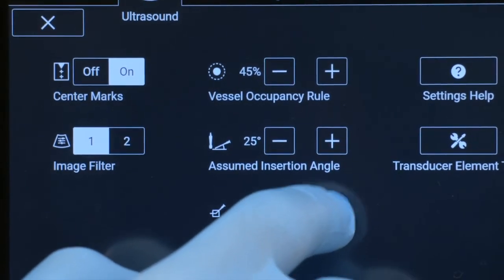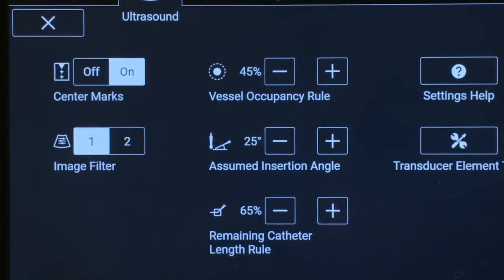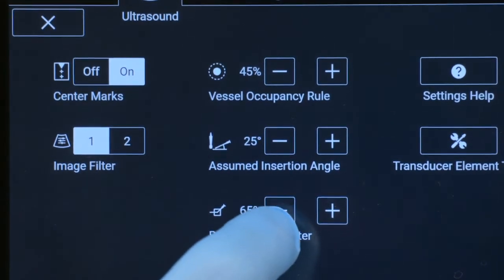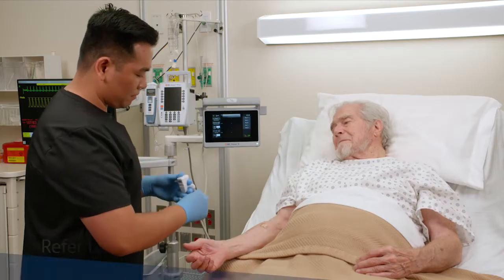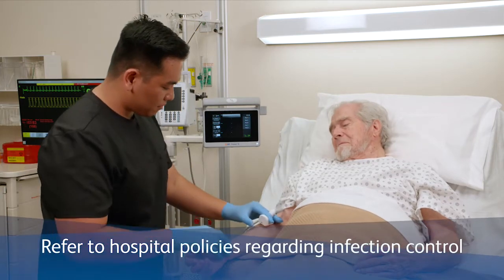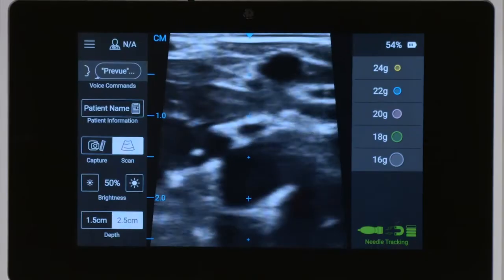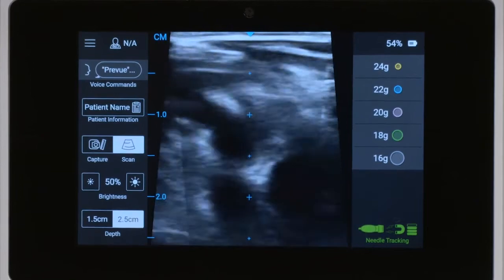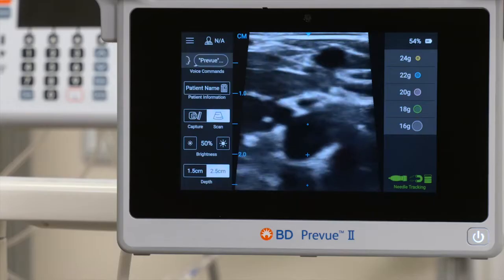For example, according to 2021 INS guidelines, 65% of the catheter length should dwell inside the vessel. Perform a pre-scan to find a candidate vessel. Selection of your candidate vessel should include factors such as vessel compressibility.